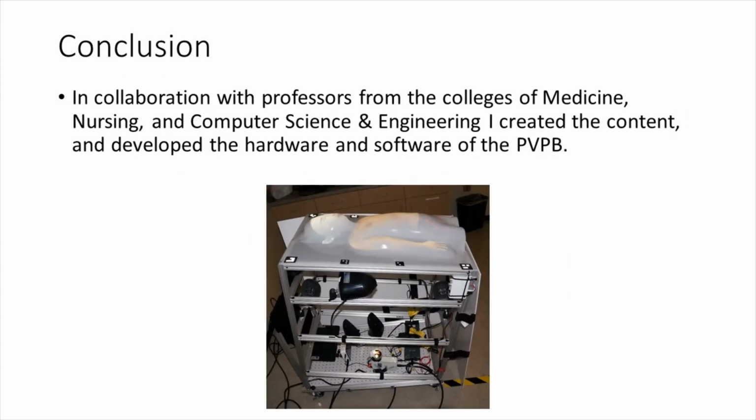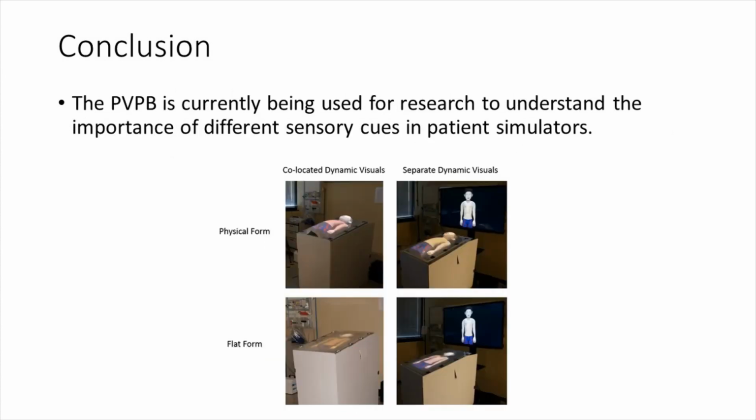In collaboration with professors from College of Medicine, College of Nursing, and Computer Science and Engineering, I created the content and developed the hardware and software for the physical virtual patient bed. The physical virtual patient bed is being used for research to understand the importance of different sensory cues in patient simulators.